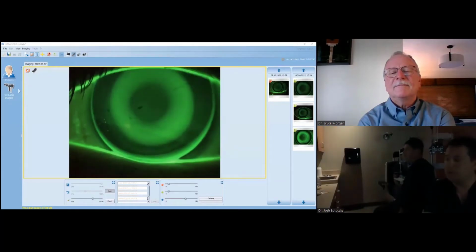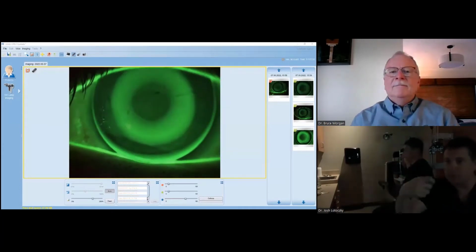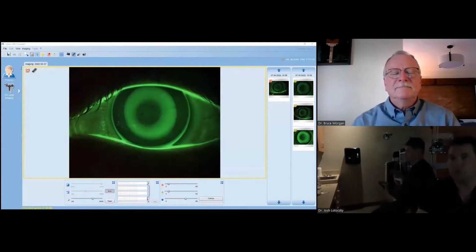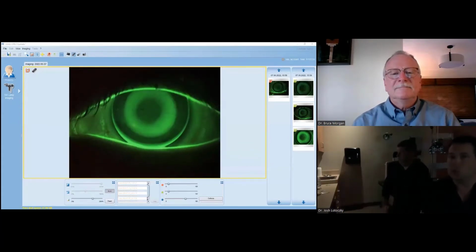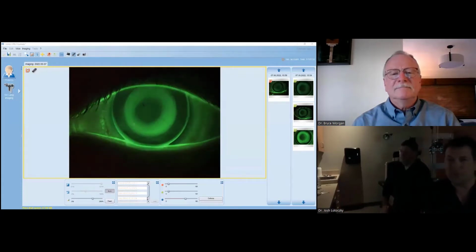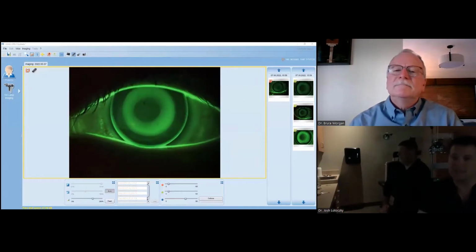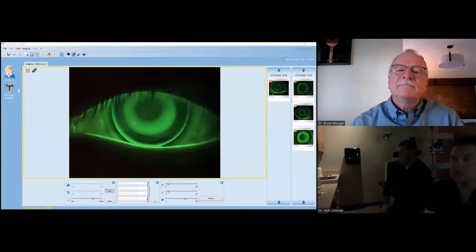One of the things is I love people that don't waste, and our students are really good about that, because we tell them straight up, I don't ever want to see you take that fluorescein strip and act like you're a painter. You're not a painter. You're an optometrist. And what do I see every time students put fluorescein on the eye? They paint it on, and then you end up with just way too much of it. And they give you this description of the appearance, and you go, well, that sounds really weird. And I go walking in 5 minutes later and it looks fantastic. And they're going, it didn't look like that when I was in there. And I said, yeah, it's because we have too much.